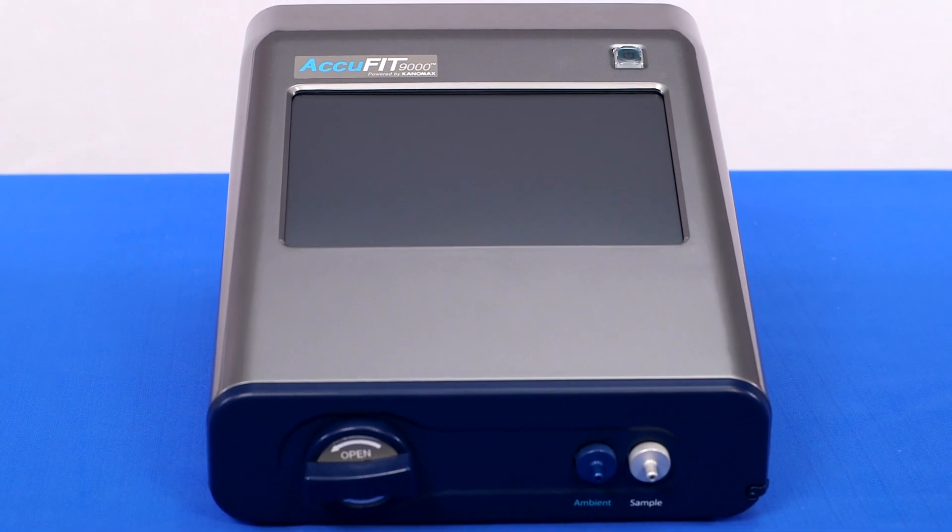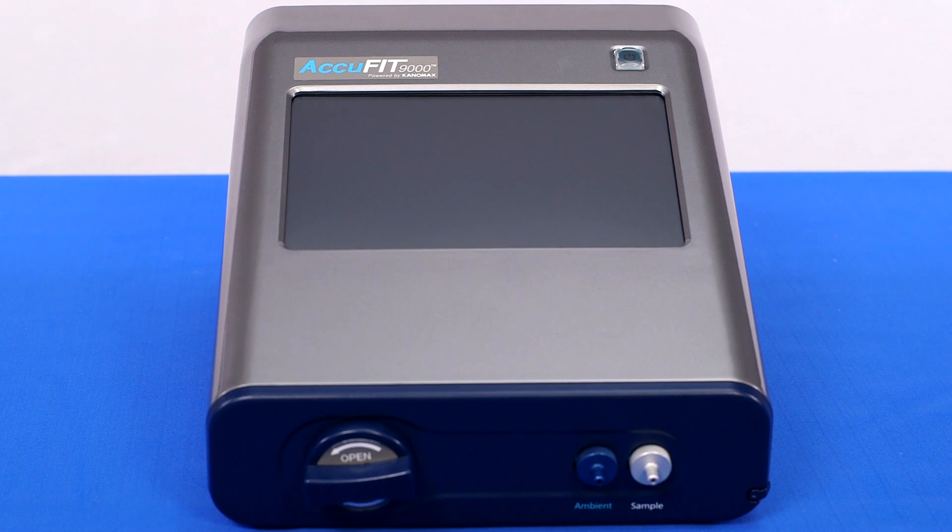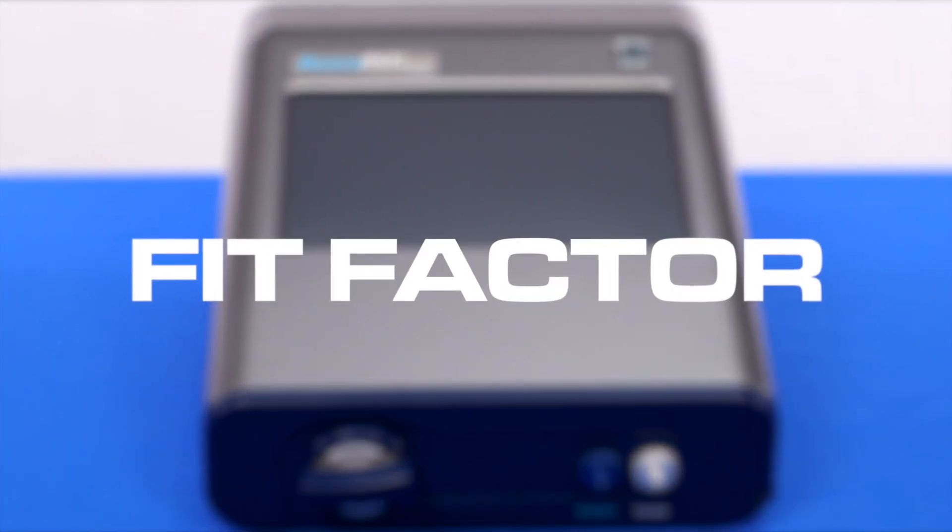The device measures particle concentration in the ambient air and inside the respirator to determine how well a respirator fits by comparing the ratio of these particle concentrations. This ratio is called the fit factor.